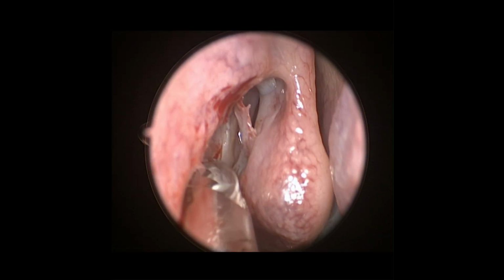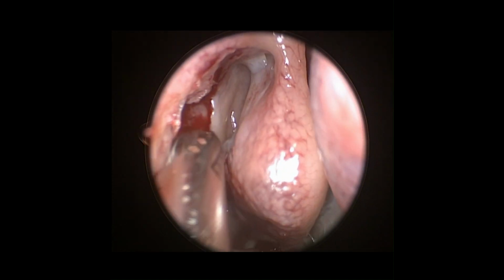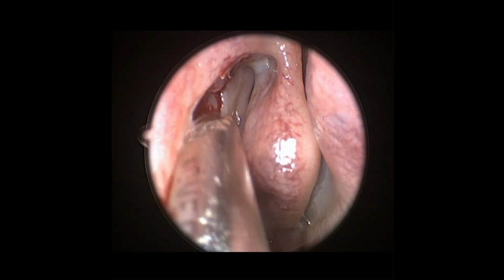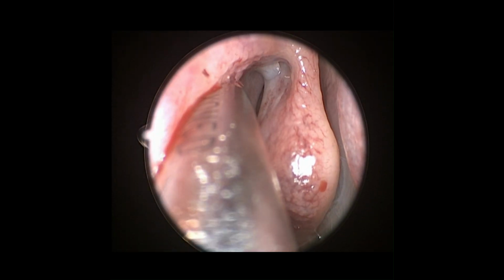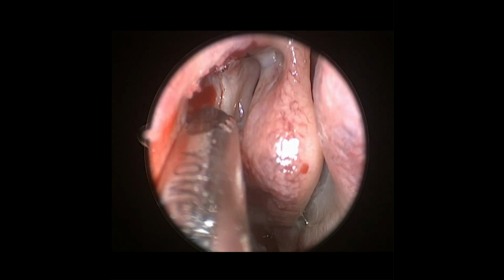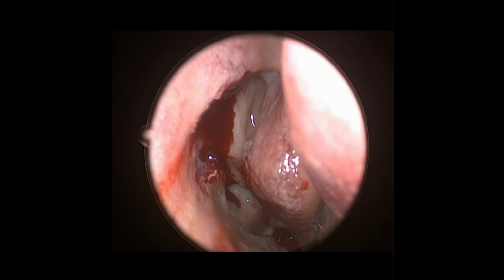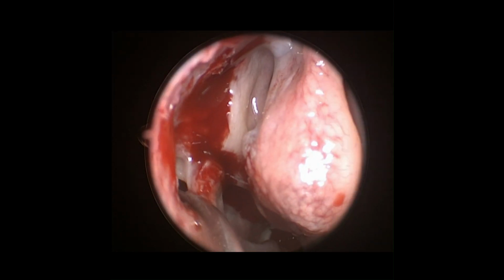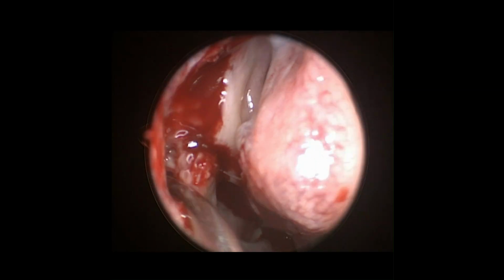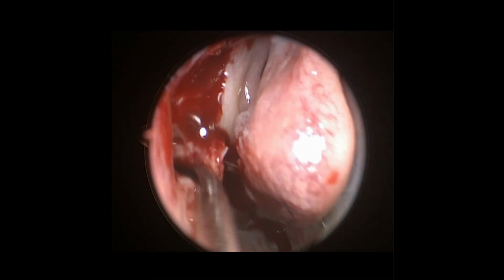The second step is identification of the maxillary antrum by passing the J-curette in a posterior inferior direction at the anterior end of the horizontal uncinate. The third step is removal of the horizontal uncinate segment.